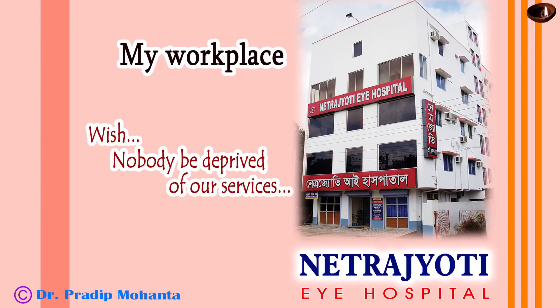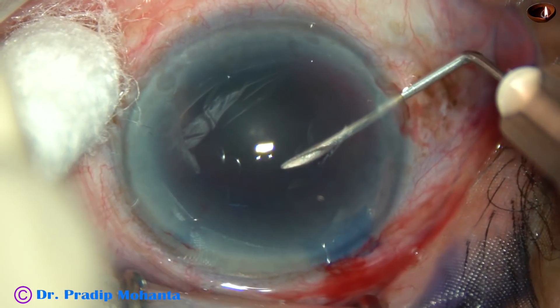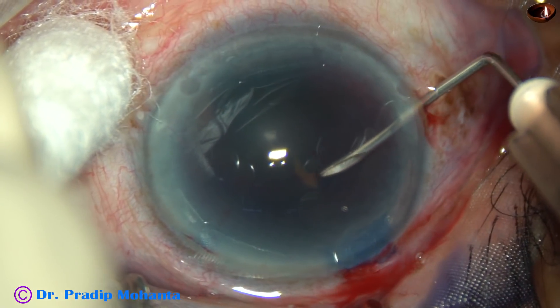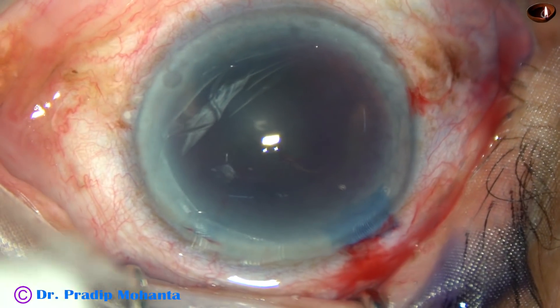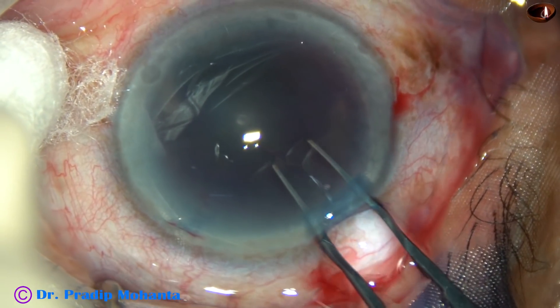Friends, welcome to my workplace at Ranaghat, West Bengal, India. This is a hard brown cataract. A lot of things happened in this case. Let us see the salient steps of this surgery.